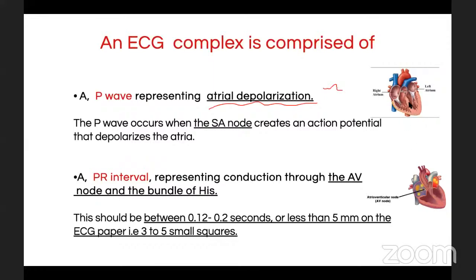أوكي، فاحفظوا إنها إيش؟ depolarization of the atria, depolarization. طيب الحين ال PR interval represents وشو؟ ال AV conduction, AV node and the bundle of His conduction. أوكي، زي ما نشوف في الصورة هنا نعرف من خلالها إنه صار في توصيل للconduction للventricles، لأنه بعدها راح يجينا ال QRS complex. زي ما نعرف ال QRS complex قلنا the contraction أو depolarization of the ventricles.